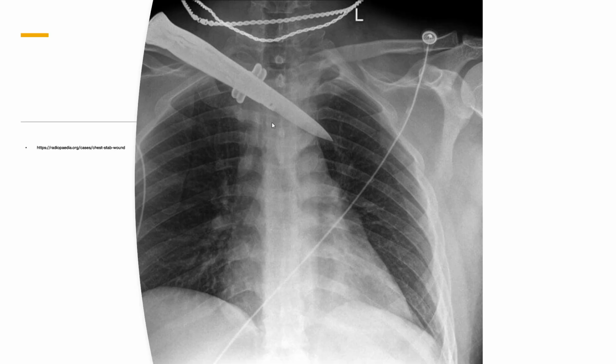So this is a really good example. This is a chest X-ray. We can look at a lot of different things on here. The first thing that stands out, other than the knife going through their chest, is all the really black color throughout their chest. All of that's air within the lungs. Everything that's white throughout there is blood vessels, helping to give blood supply to the lungs. And everything that's white through here is bone. These are radiopaque because bone is a little bit more white than the lungs, which are filled with air.